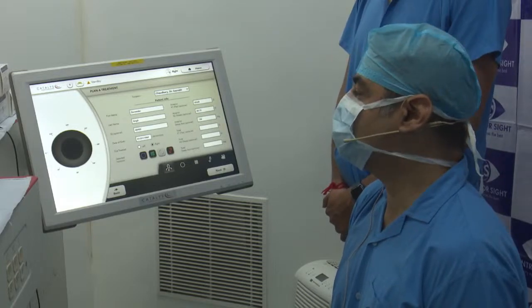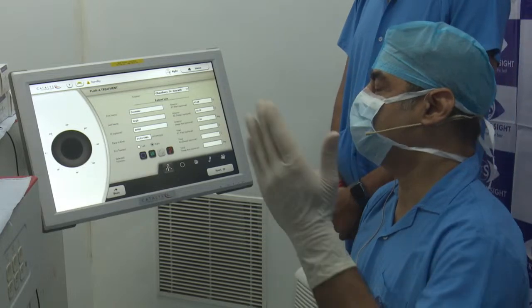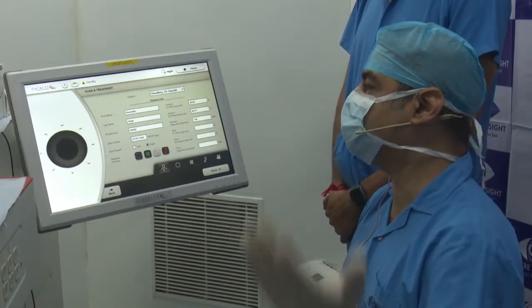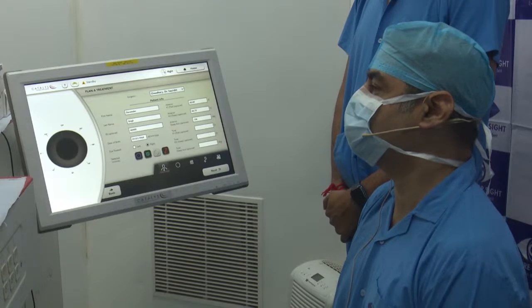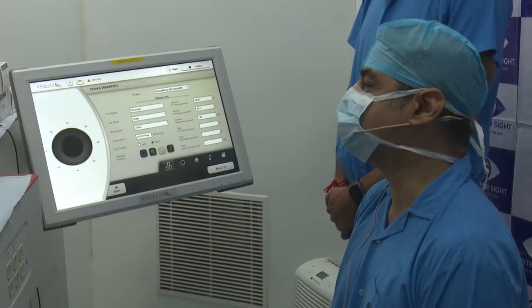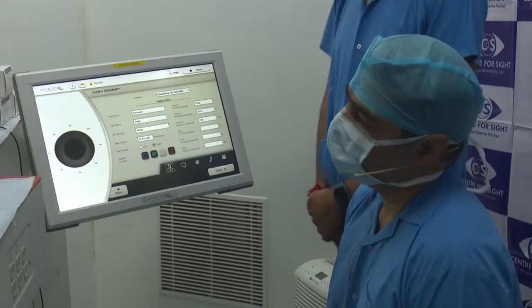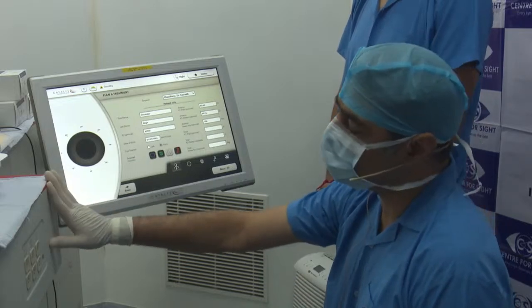Yes, I'm going to start with the femto, which I'll show the femto procedure, and then I think Dr. Harbanslal will do the safe surgery, and after that, I'll take the patient for surgery in the OT. So, good morning, everybody, and I'm going to show you the femto procedure.